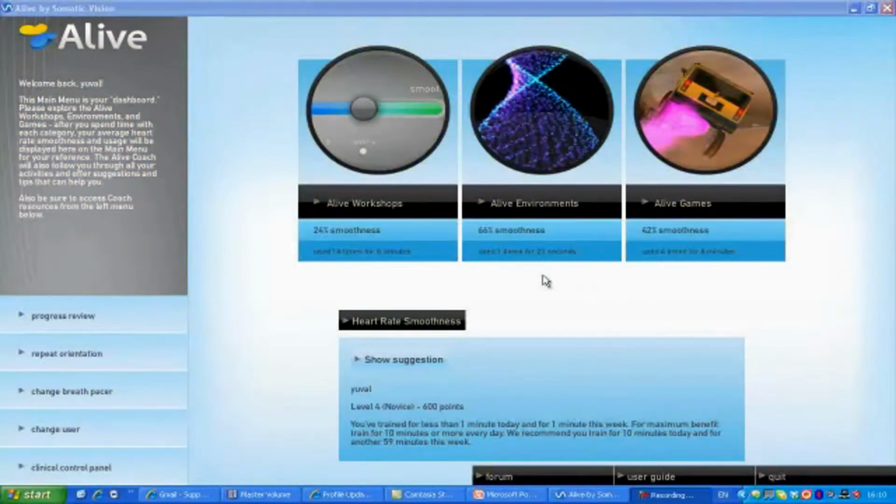First, a quick note. Alive now works with two different hardware platforms, which each collect biodata. The main difference between the data collected is that the Wild Divine IOM finger sensors collect skin conductance level, or skin sweat, measurements, whereas the HeartMath M-Wave sensor does not measure skin sweat.